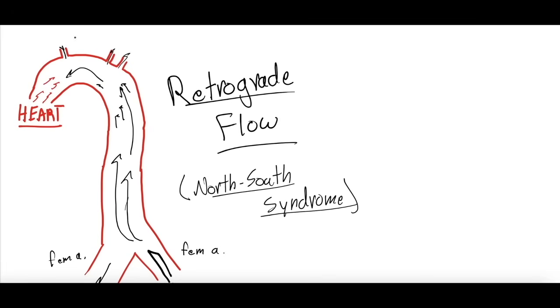And depending on how well the heart is working, at some point you may get pooling somewhere in here. So if the heart isn't working well, this retrograde blood that's oxygenated from the ECMO circuit can travel all the way up the aorta, go out of the vessels. These go to the body, go out of these vessels. Some of these vessels go to the brain, and then get to the heart and perfuse the heart.